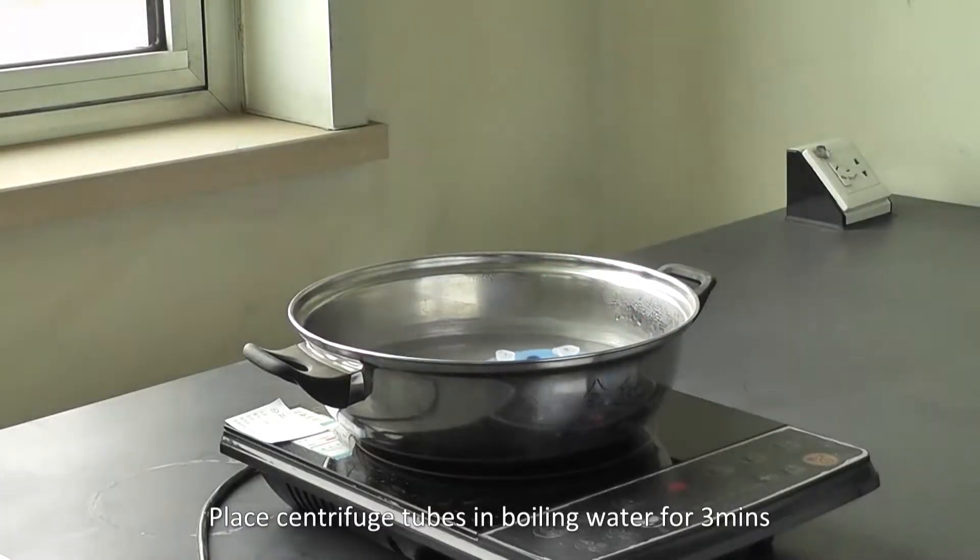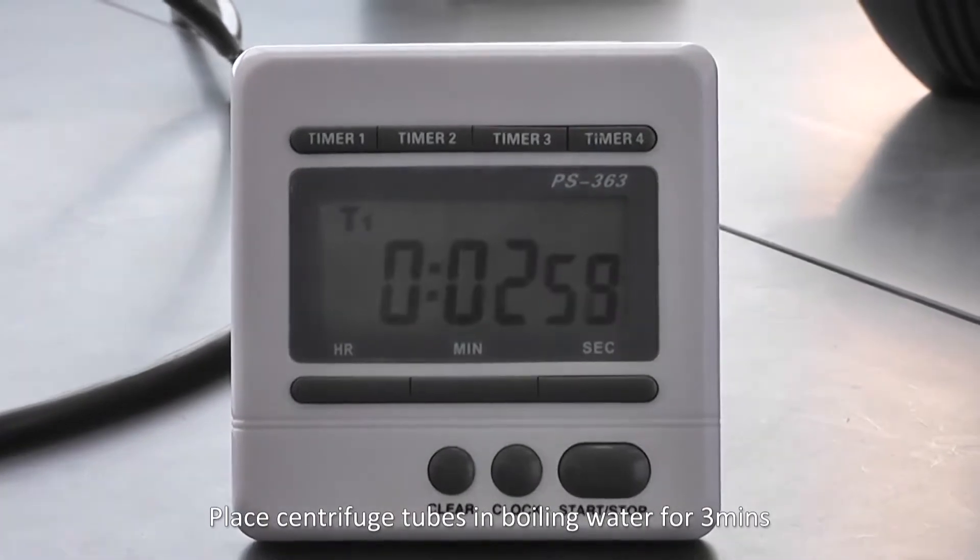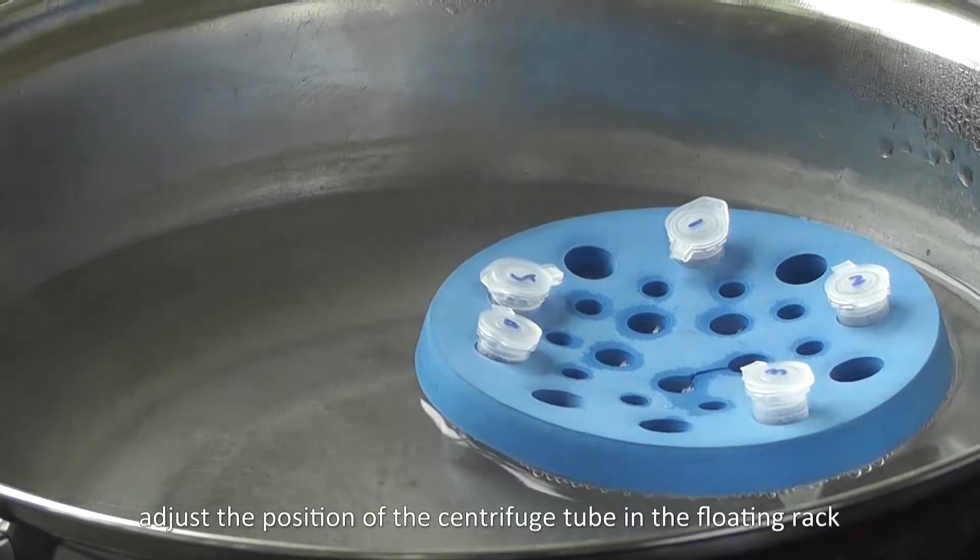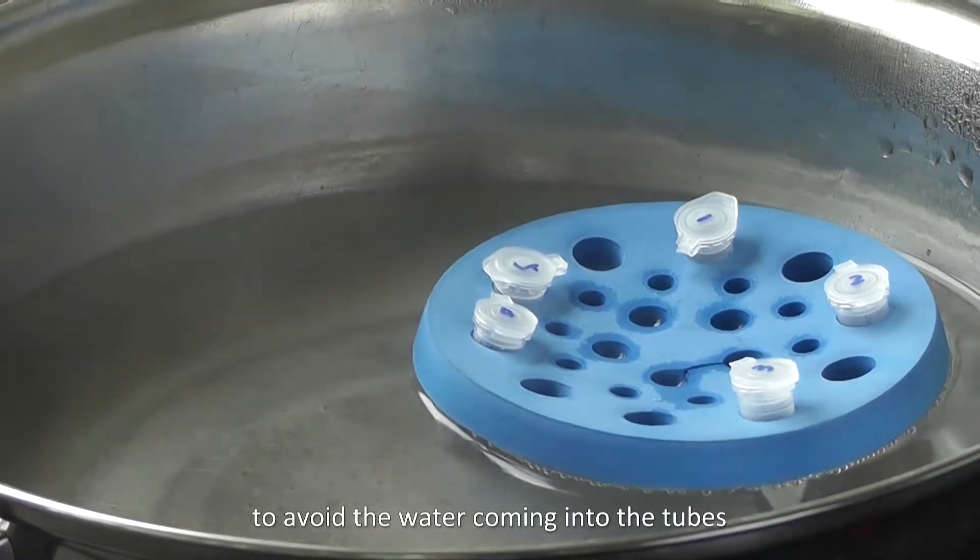Place the centrifuge tubes in boiling water for 3 minutes. Adjust the position of the centrifuge tube in the floating rack to avoid the water coming into the tubes.